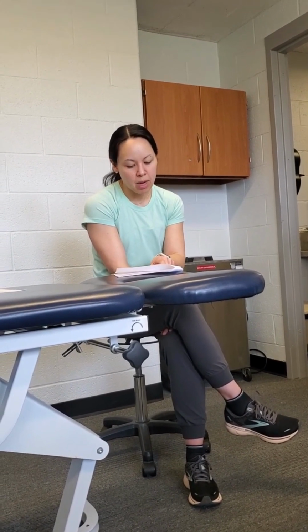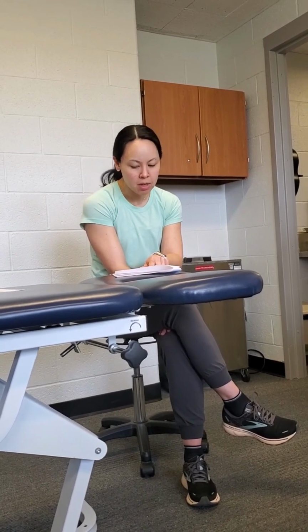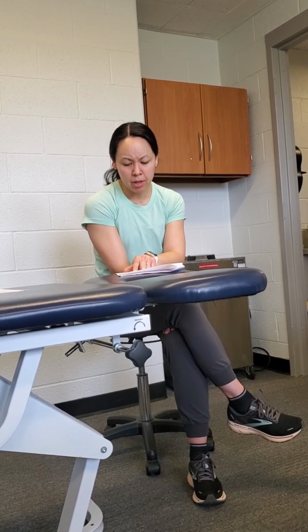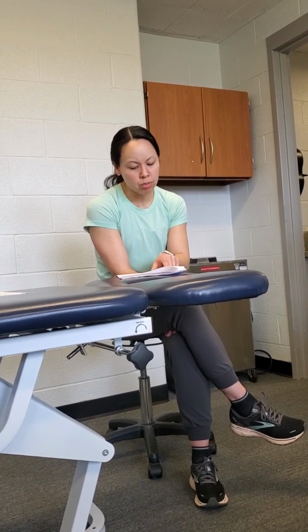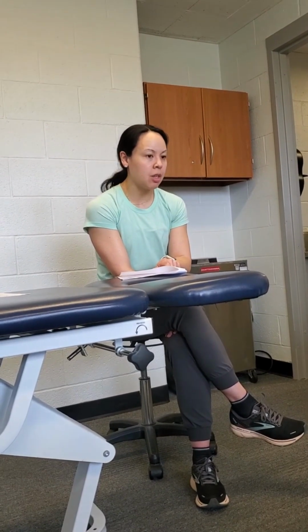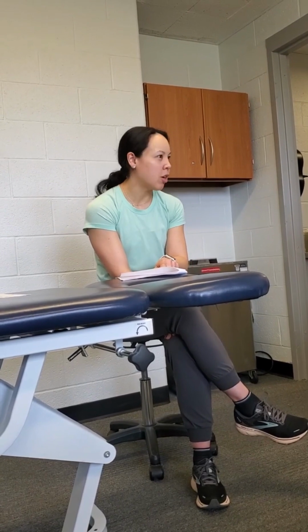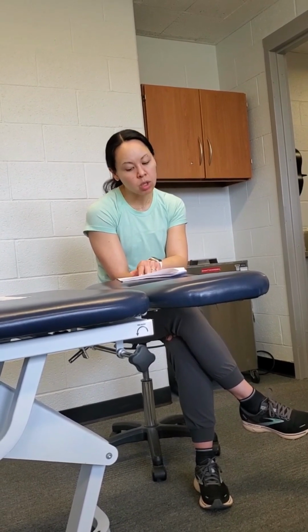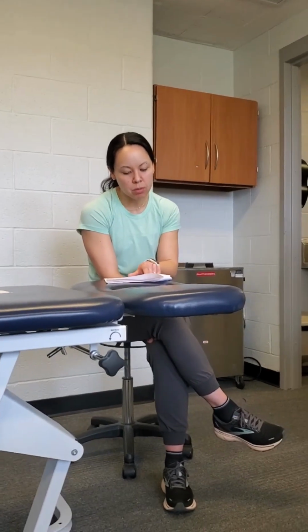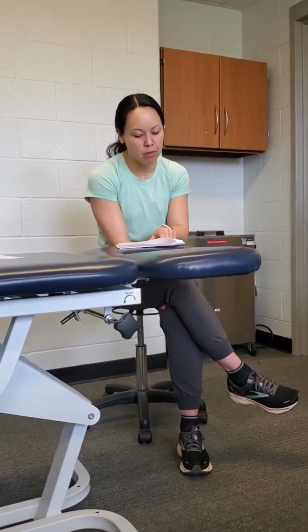There was a pilot randomized control study on the anterior knee, patellar tendon pain, back in 2018. They had them do long quads at 80% of their limb occlusion pressure with a pain rating of 4 out of 10 or lower being okay. The clinical implications are that low BFR exercise may be used to reduce pain and provide a window of opportunity for clinicians to optimally load otherwise painful tissues and joints.